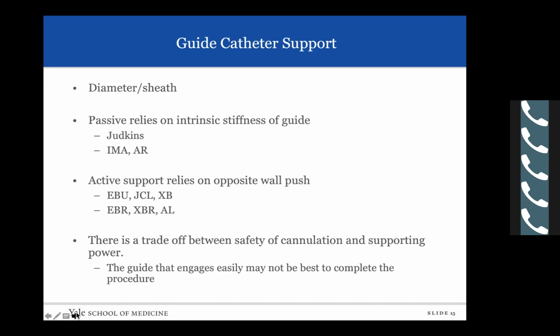So the more supportive guides are bigger and deeper and more aggressive, and thus they're less safe. They can dive in, they can be sucked in when you're pulling equipment back, and you also have to certainly be careful about ostial lesions. And just remember, a guide that engages easily for a diagnostic case may not provide the support you need for the procedure to get the gear where you need it to go. So you may have to choose different catheters. But from a safety perspective, that's why diagnostic catheters are typically passive support.